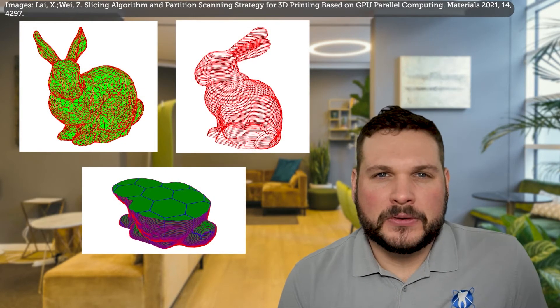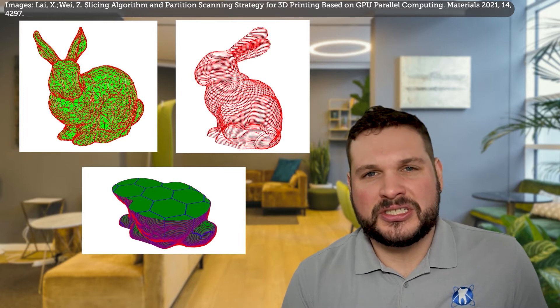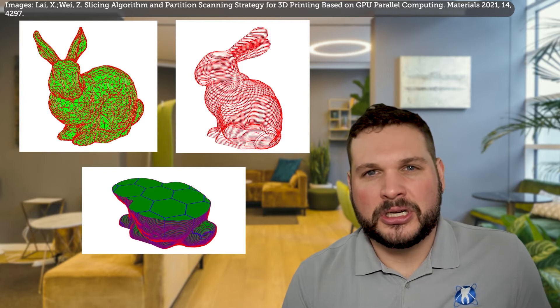DMLS follows the same basic process principles as most 3D printing technologies: scan, slice, and print. Once a 3D model has been designed, the image is broken down into small slices and the printer adds the material layer by layer until a three-dimensional physical model is made.